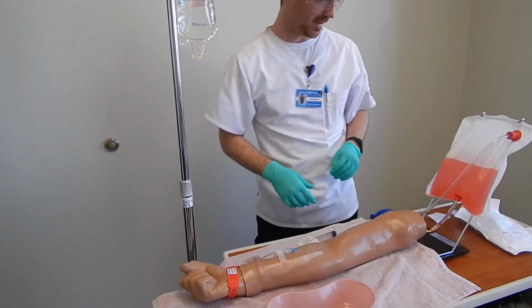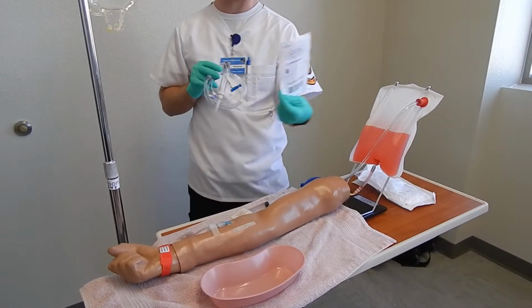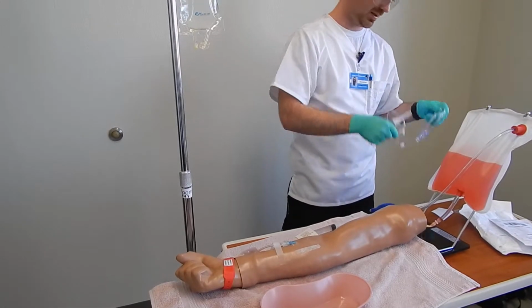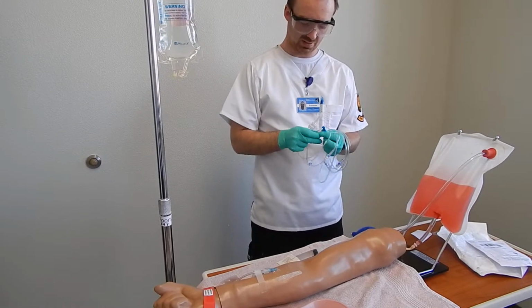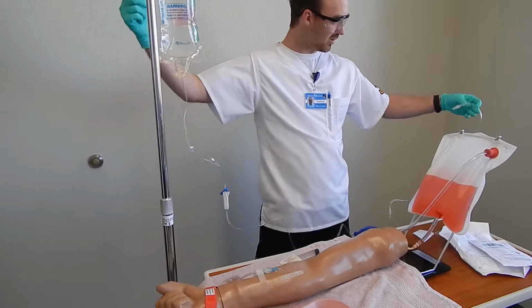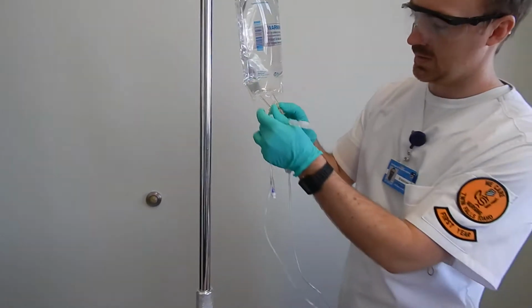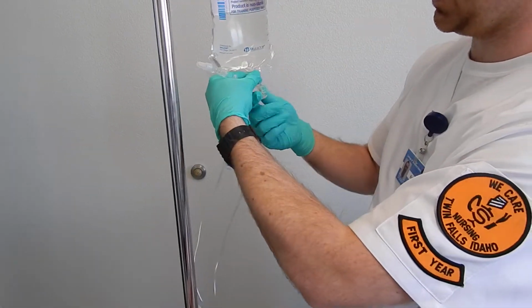Put that on there. Next I'll open up my IV tubing. My IV tubing, 15 drips. So open this up. Go ahead and tighten up my roller here. Make sure that I have no kinks. Everything looks okay there. Then open up this. Careful not to touch the sides of it.